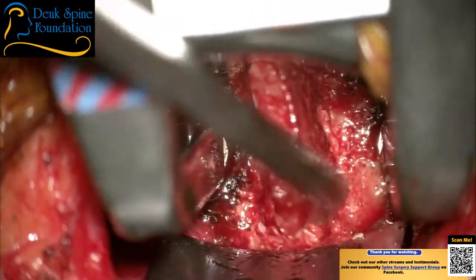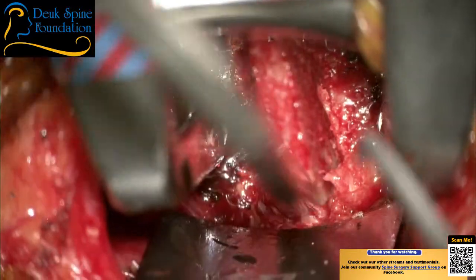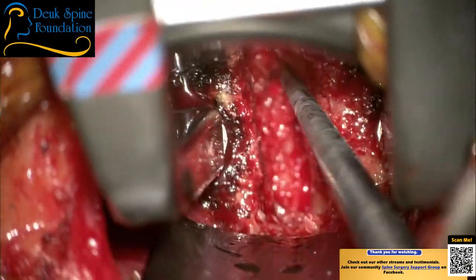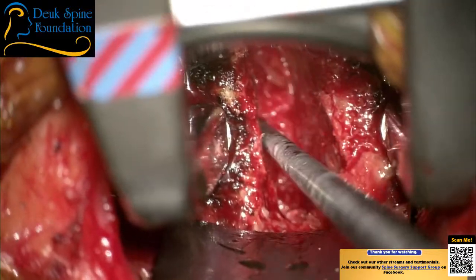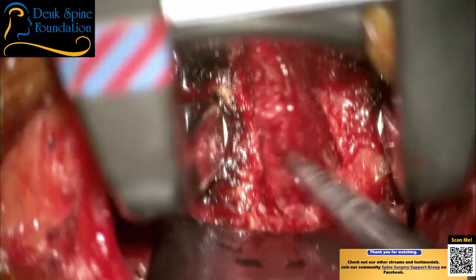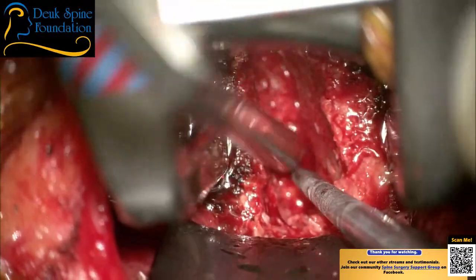I think this is going to be a 7. Is that a 2? Yep, that's what I need. So this is the back of the disc. This is where the worst herniation is. And this is part of the herniation right here. I'm pulling it out off of the spinal cord. Suction, please. I need your help, Dr. Patel. Pituitary and sucking.